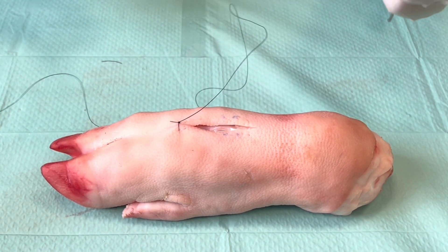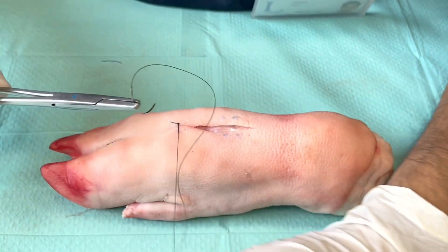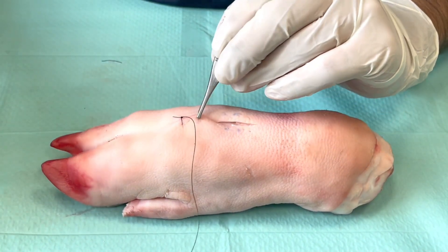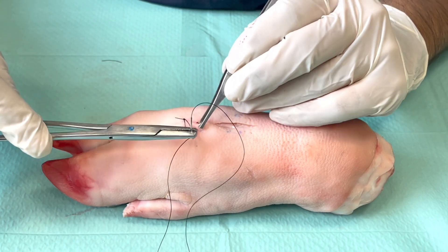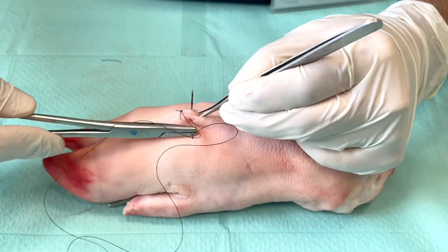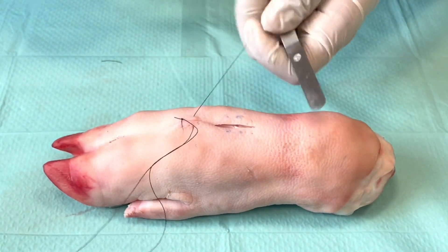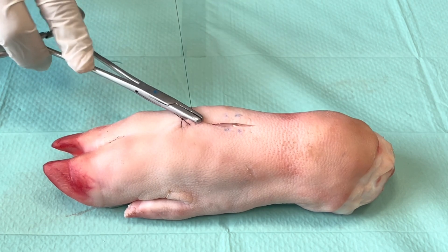Now we take another bite a few millimeters down the incision in the same way as we took the first bite. You go on both sides about the same distance from the wound edge, pull up on the thread, and hold the thread for some tension.